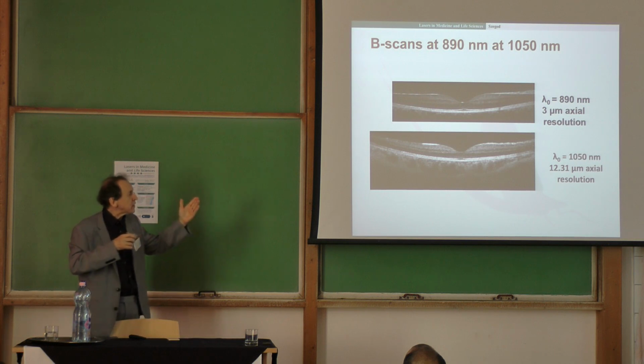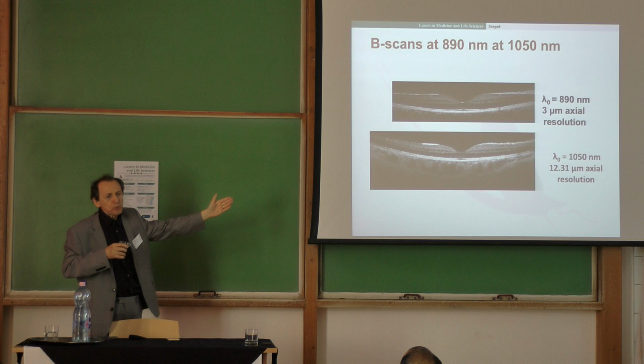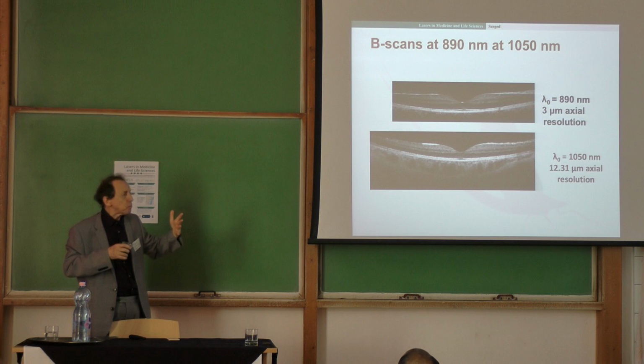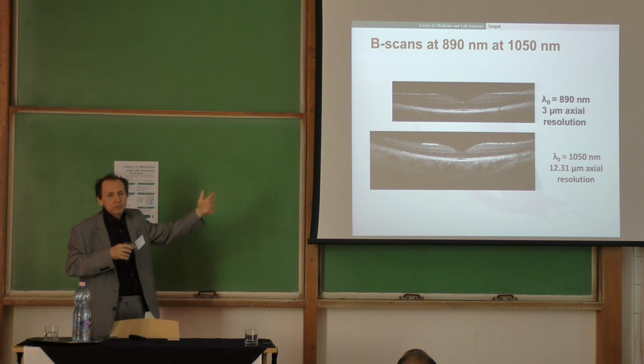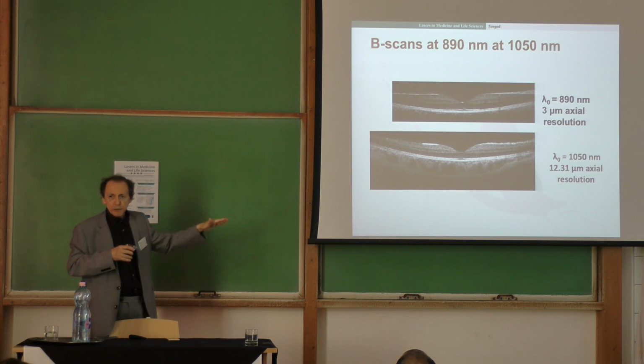The laser safety, that's also true, that the safety power is different. That wavelength is 0.75 milliwatts. Here we can apply up to 1.7 milliwatts. And that's what has been applied here. So it's a little bit more power, but it's still under the safety limit. If that is what you meant, both are OCT systems in our lab, and these are images produced by many groups, similar. But that shows that by changing wavelengths you can penetrate more. Take that message.